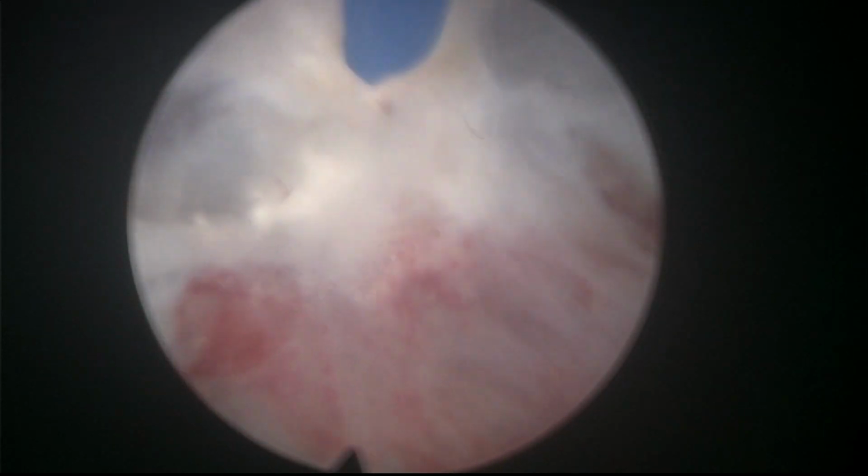You always have to read the information you get on the screen. You have to be very vigilant to see the anatomical details that will tell you if you're doing the right thing. Here you see I am posteriorly working near the adenoma. You see my fiber is keeping close to the adenoma, so the capsule is receiving very little energy. It's just going to the adenoma and in a way that cuts the attachments of the capsule with the adenoma, so there is very little chance of going deep in this region.